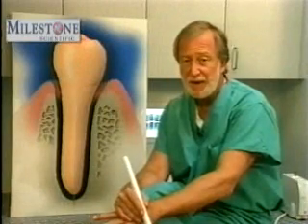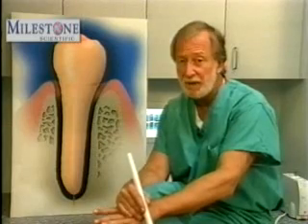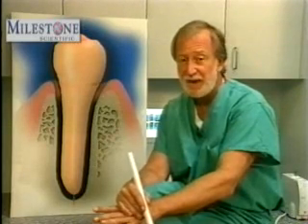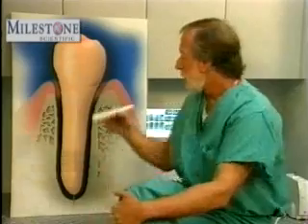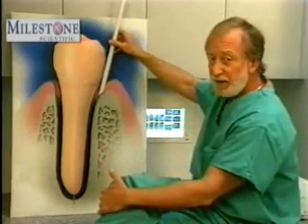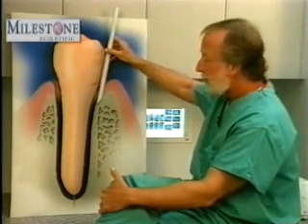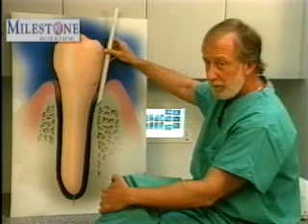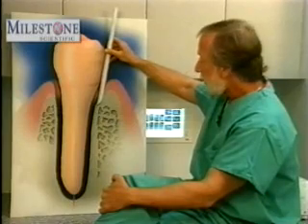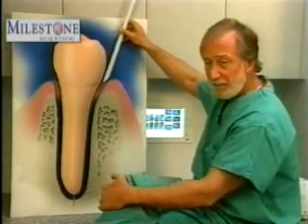In doing the PDL, everything feels right. No anesthetic is leaking into the patient's mouth. However, there's no blanching, and when I remove the needle from the patient's tissue, a lot of anesthetic flows into the patient's mouth. What is happening is improper technique. If the bevel is facing against the bone, it is likely that the needle will become obstructed by the bone, preventing the blanching from occurring and preventing the anesthetic from flowing out. When you remove the needle, the pressure inside the tubing will force the anesthetic into the patient's mouth.